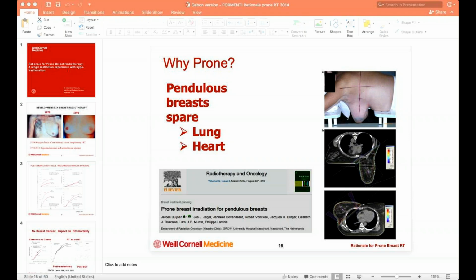But whatever scars are present, you have to make sure that it's covered. So what you need to do is make sure that at the time of CT simulation you wire the scars. I make sure to wire any scars that are present at the time of CT simulation so that I can make sure that the field is covering them once I put on my treatment fields.